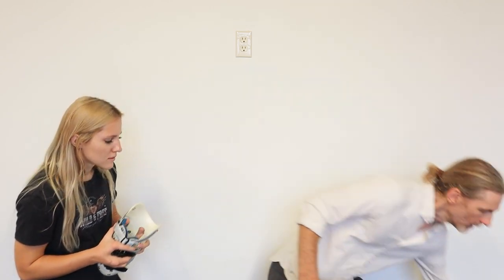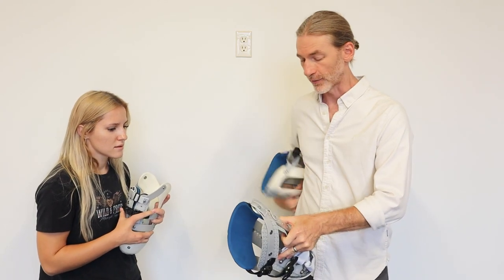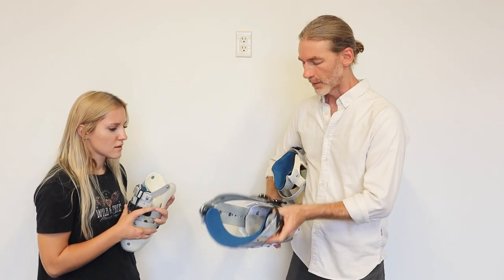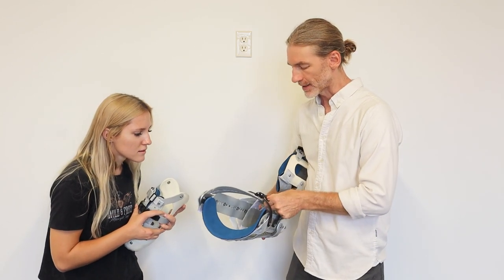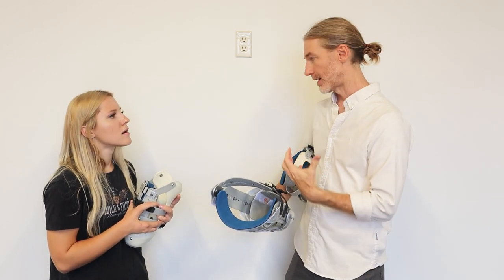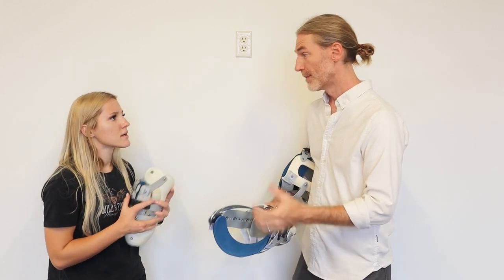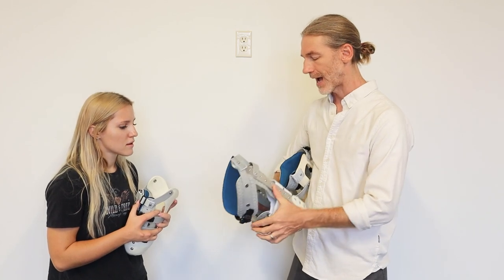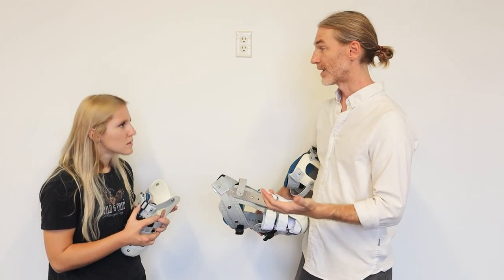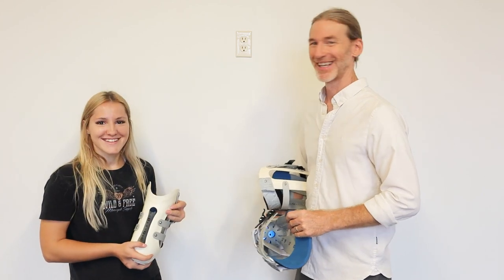Our latest technology is called the soft socket. We have this for above-knee and below-knee levels. We've incorporated an internal fabric panel that as you tighten up the socket, it is hugging the limb with fabric, making the margin of comfort even greater. It's really amazing technology and allows us to have a lot more modularity and adjustability. I'm excited for you to try it on — let's get to it.